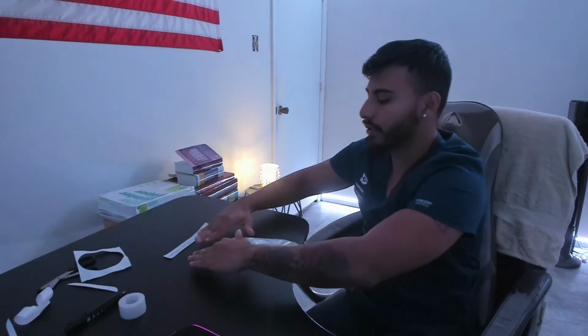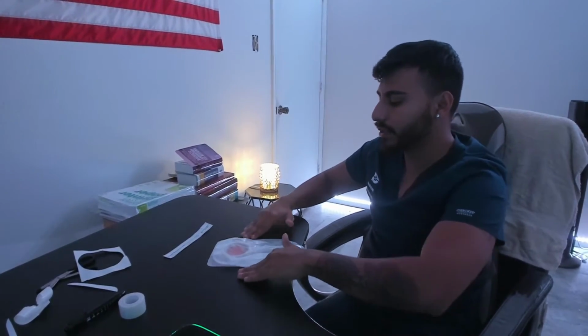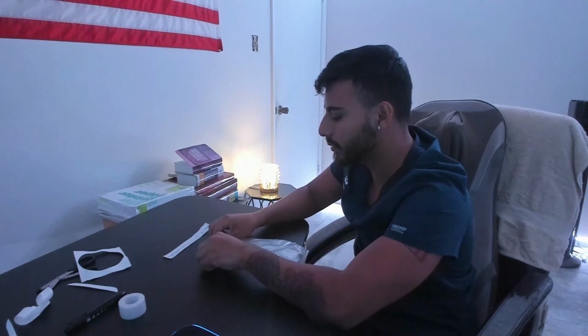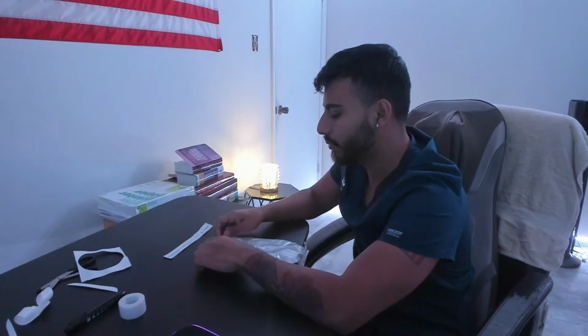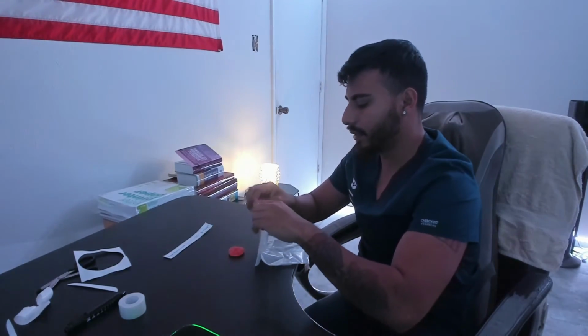Rail down, perform hand hygiene, put on some gloves, and I start by pressing down on the skin, press it down away from the pouch, and I go ahead and start peeling it out. Peel. I immediately dispose of my pouch.